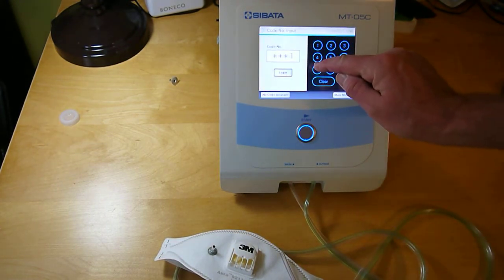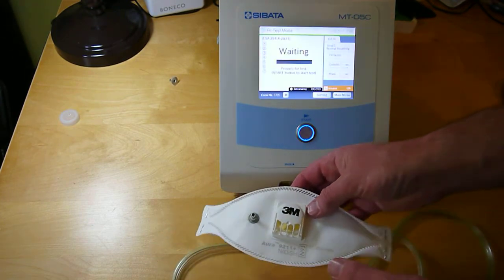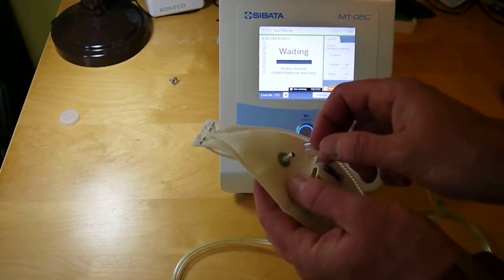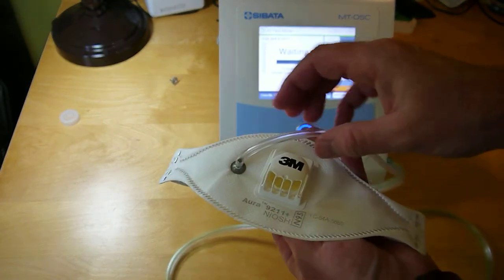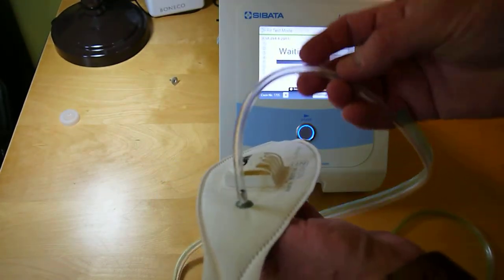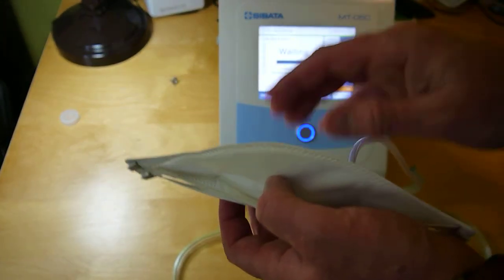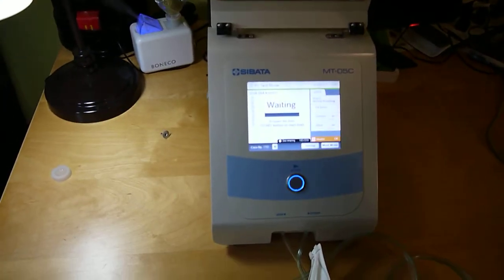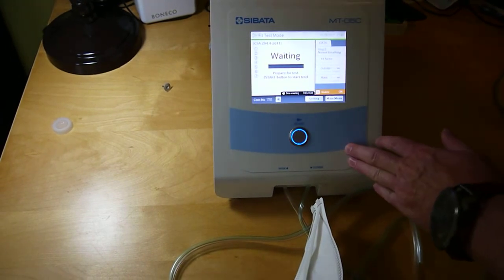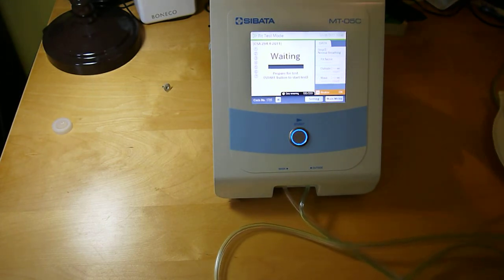Hit the fit test option and enter in the employee number. Have the person put on the N95 mask and attach the probe — the connector is covered in a separate video. Put the clear tube into that port, have them put the respirator on, and use the mirror on the back of the unit so they can see themselves putting it on correctly.